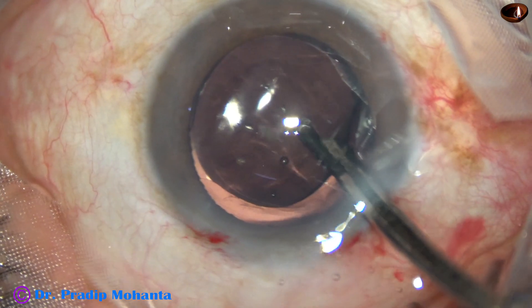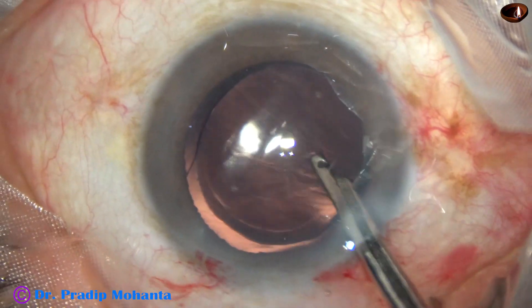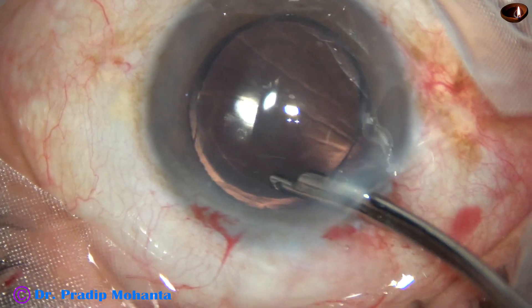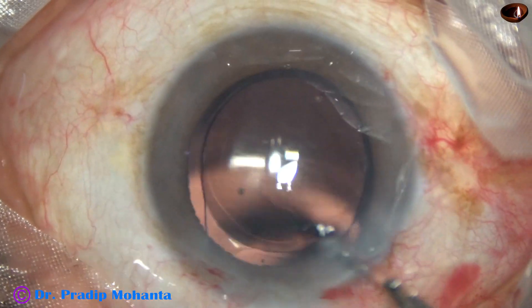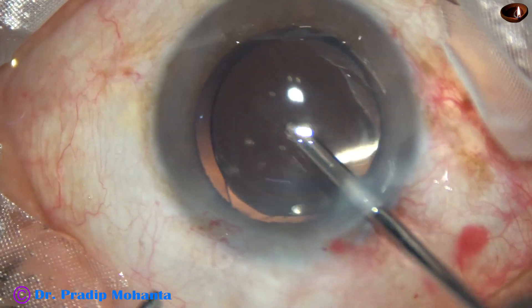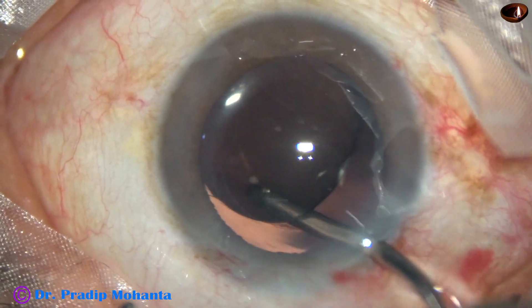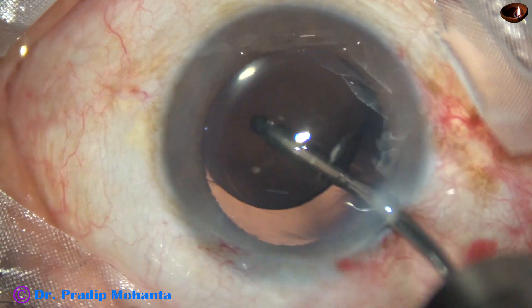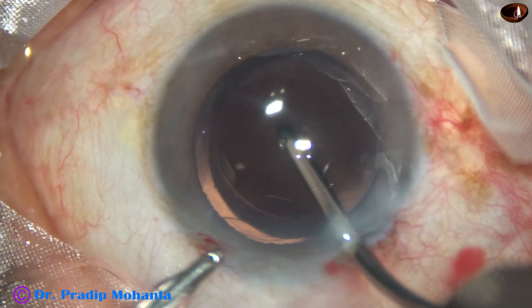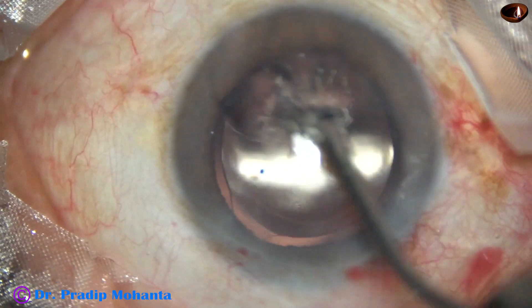I've gone behind the optic, cleaning the debris and irrigating fluid so that viscoelastic trapped behind the optic comes out. Some more cleaning of the anterior chamber, then using the irrigating probe of bimanual irrigation-aspiration — irrigating the anterior chamber first, then going behind the optic and irrigating the back. Always irrigate the back: it removes the visco trapped behind the optic and polishes the posterior capsule a bit more.